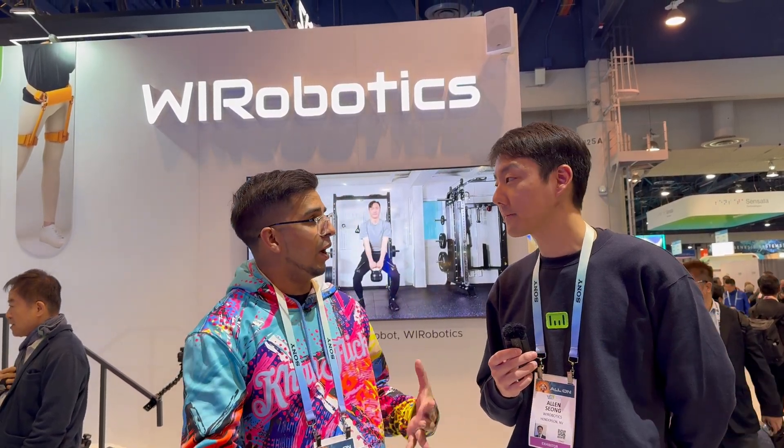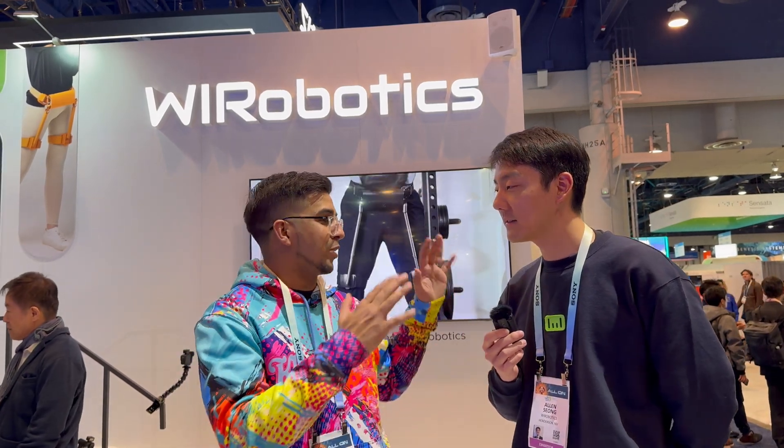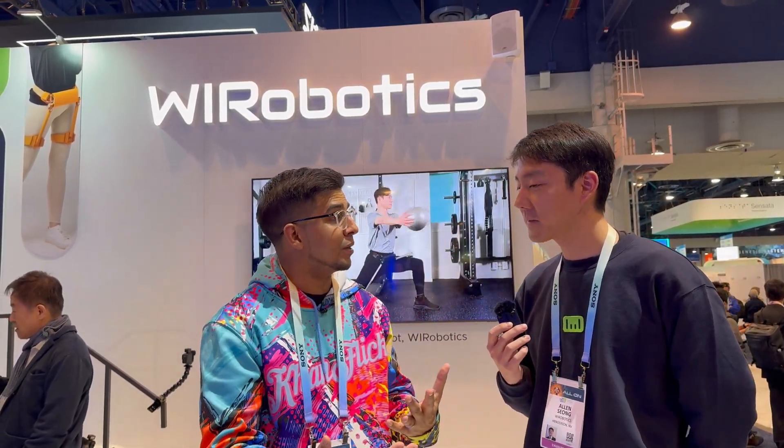Now this here is like a supporting — an exoskeleton? That's correct. All right, so I got Alan here. Alan, can you please tell us more about the product itself?